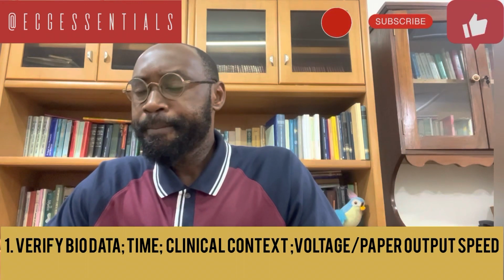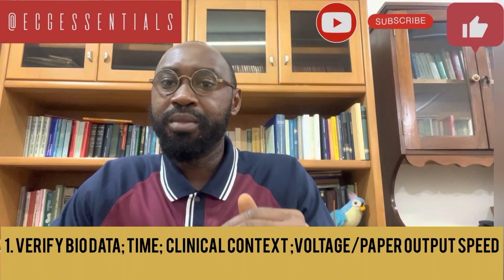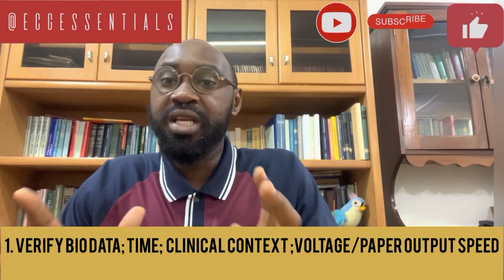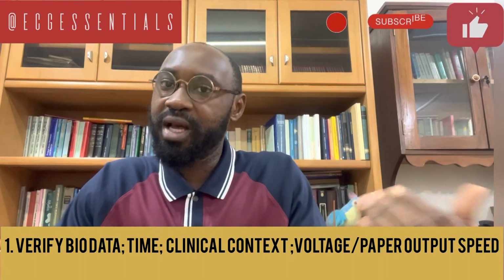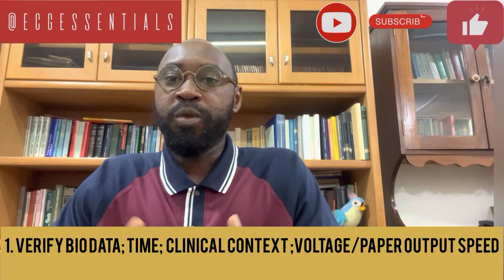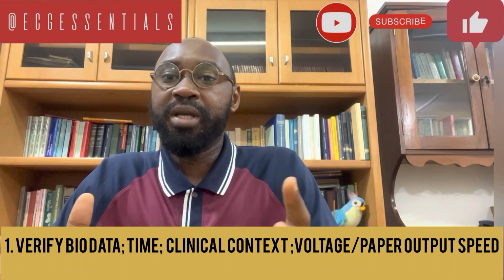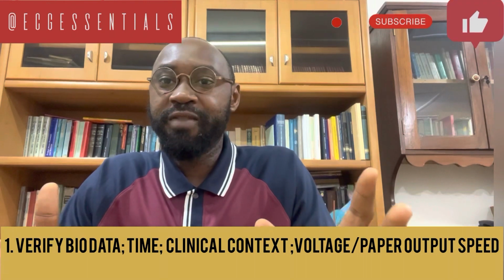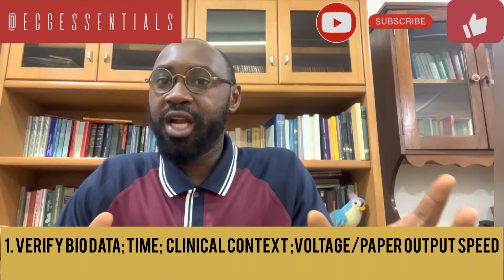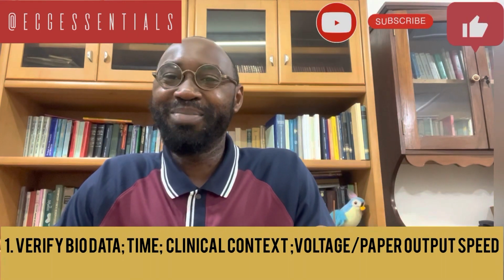The other points that we need to confirm or pay attention to will be the paper output speed, as we discussed in our earlier sessions. We mentioned that for the standard 12-lead ECG, we have a standard paper output speed of 25 millimeters per second. And also we did mention that although this is the usual standard, we are able to increase the speed or decrease the speed if need be.